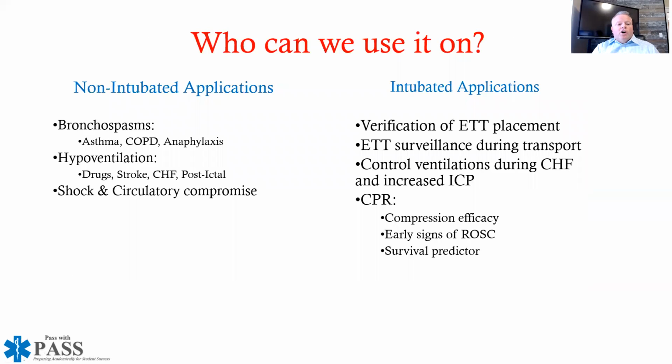Who can we use it on? Different patients, and it depends on how you want to approach this, but definitely intubated patients. That's really a no-brainer. And I just told you that we did the updates for the 2020 American Heart Association guidelines, class 1 recommendation. If you have capnography, you need to be using it. It's a class 1 recommendation, which means that not only is it beneficial, they know that there's not going to be any harm that goes along with it.